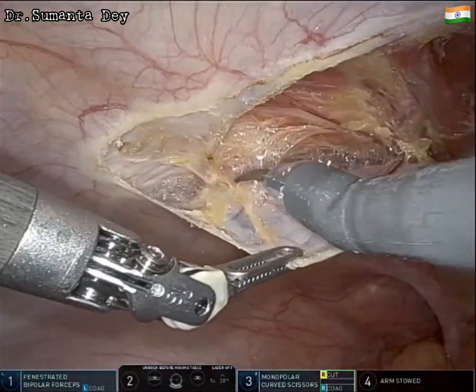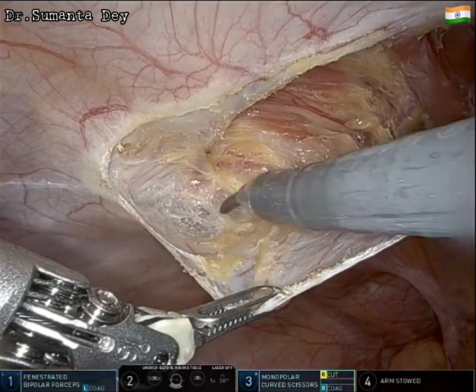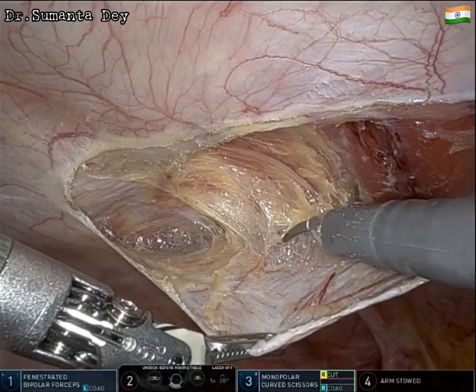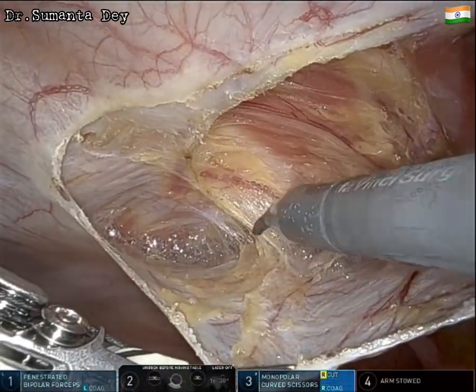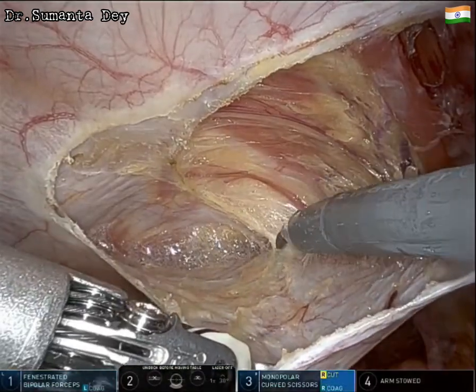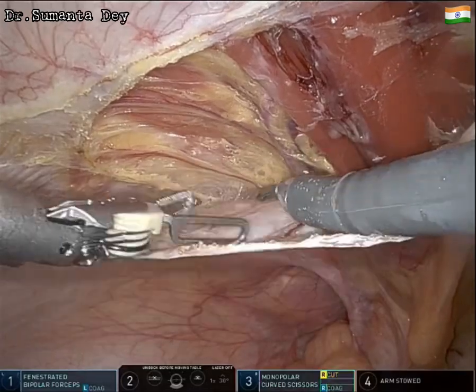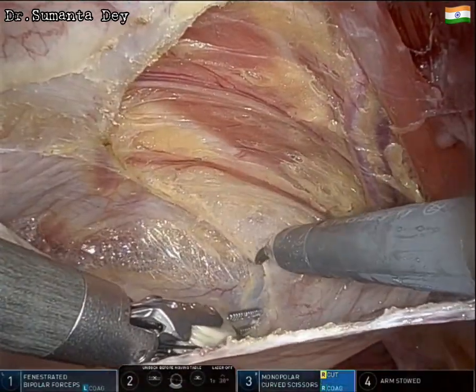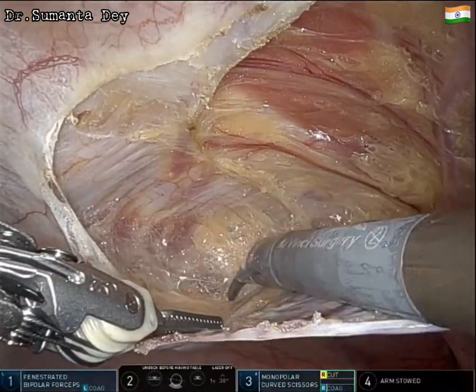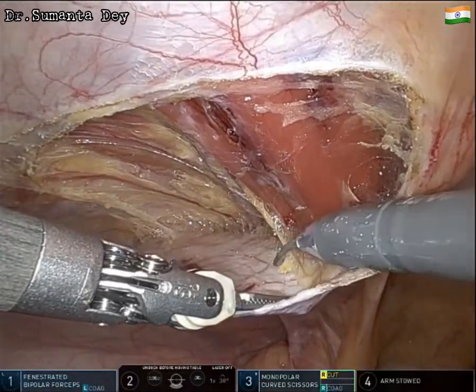The peritoneal incision is given at least five centimeters proximal to the upper border of the defect, gradually creating the flap. Above the arcuate line it is partially retrorectal, and below the arcuate line it is extraperitoneal or pre-peritoneal. Laterally there is the pre-transversalis plane, and as we go down, these two planes merge to form one pre-peritoneal plane.